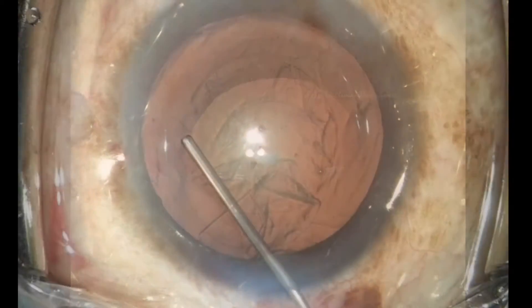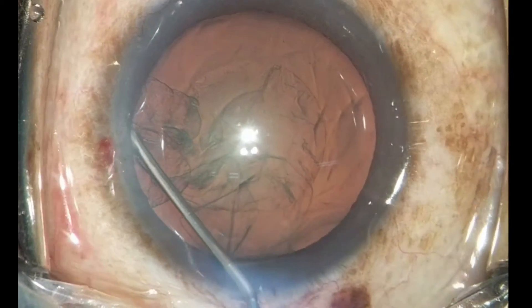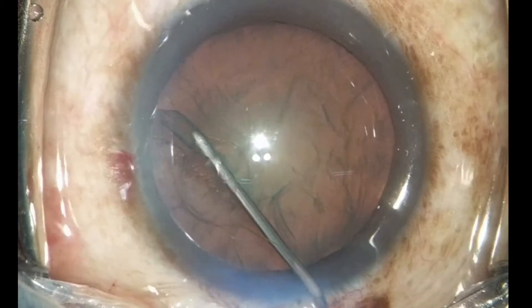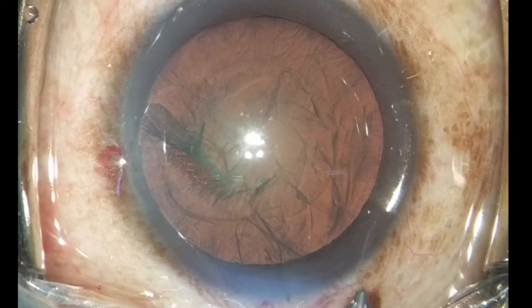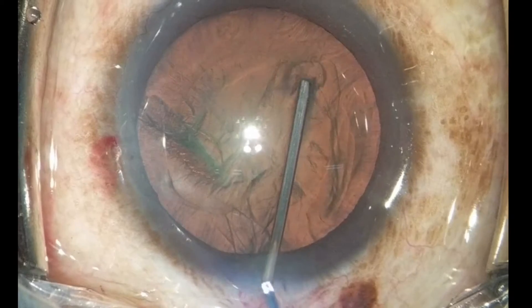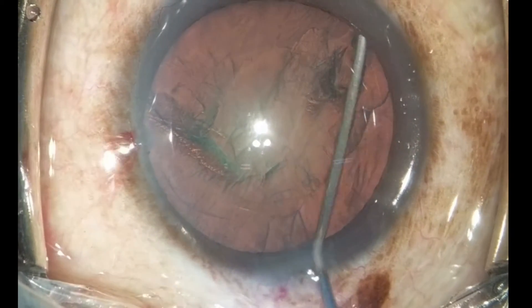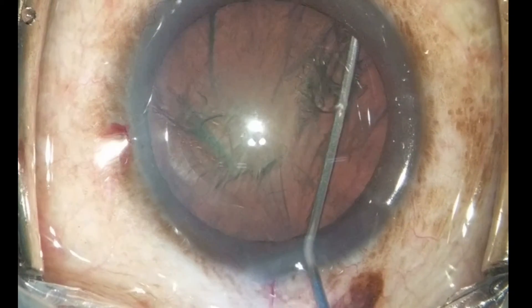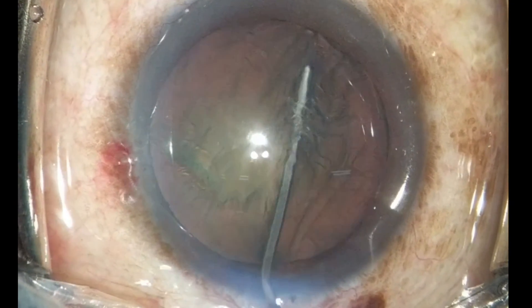Notice the tenting of the rhexis rim with the hydro cannula before injecting the hydro wave, and the dipping of the nucleus down after injecting. Dipping the nucleus down cleaves the anterior attachment between the rhexis rim and the lens substance.